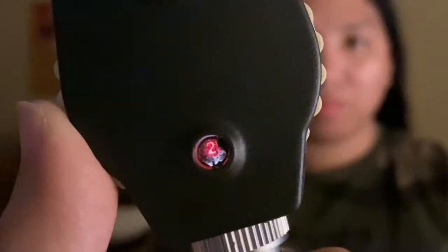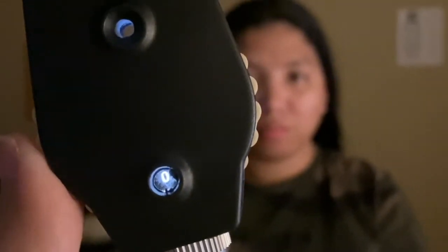For the direct ophthalmoscopy exam, we position the patient about 2 feet away. Turn off the light to dim the room illumination. We then set the focusing lens of the ophthalmoscope to 0. Obtain the red reflex by examining the patient from a distance of 2 feet.